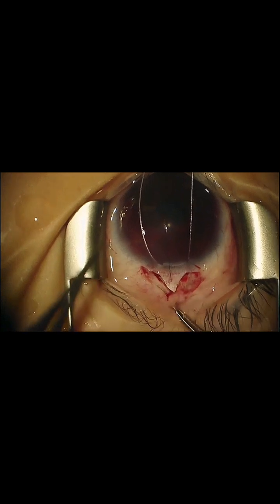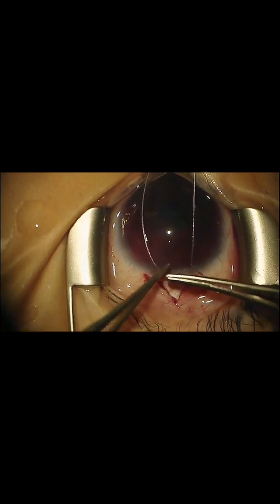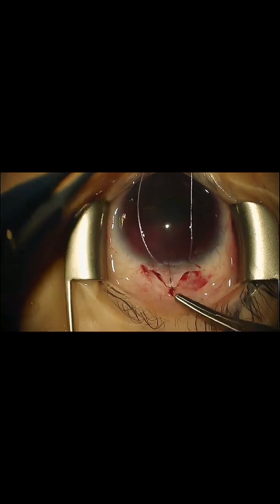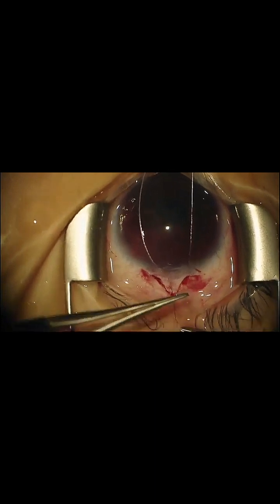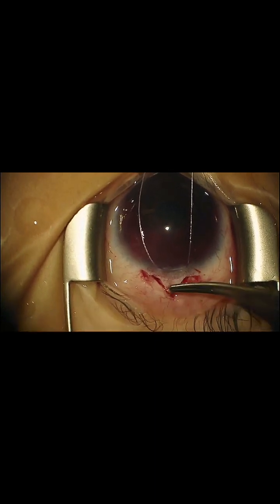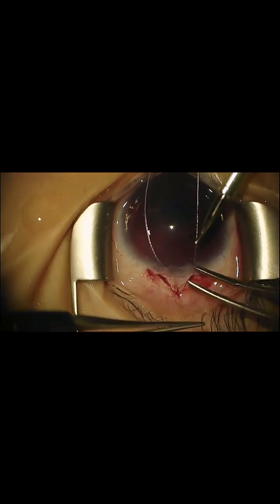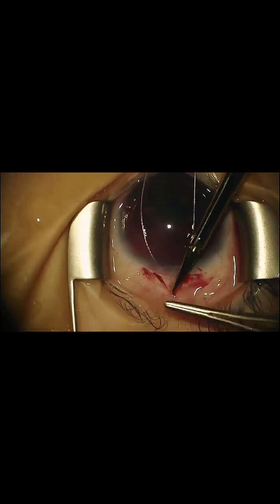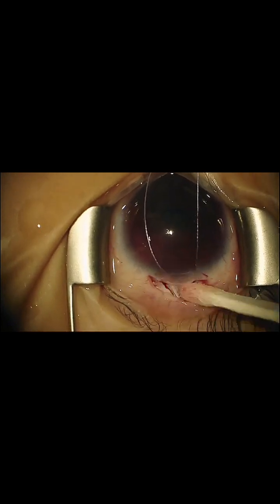Trabeculotomy has the advantage of being able to be performed in all glaucoma patients, whereas goniotomy you can only do in an eye with a clear cornea. Goniotomy is a nice technique. Problem is, I imagine, especially in developing countries, the referral system is not very prompt, and so the patients arrive late with cloudy corneas.